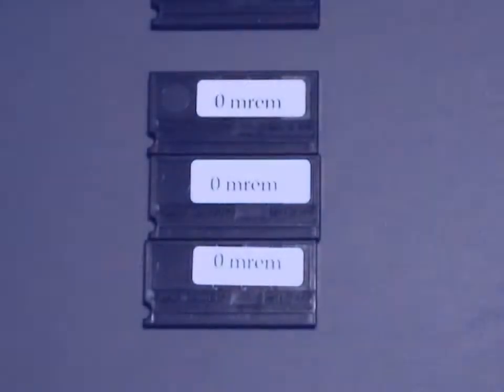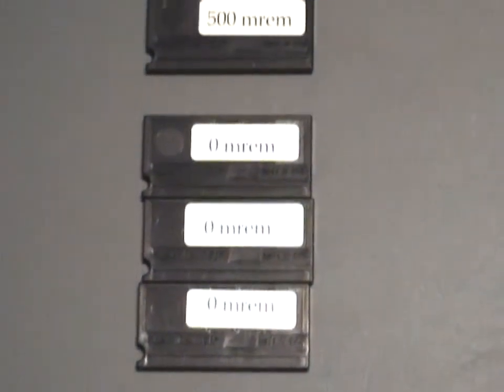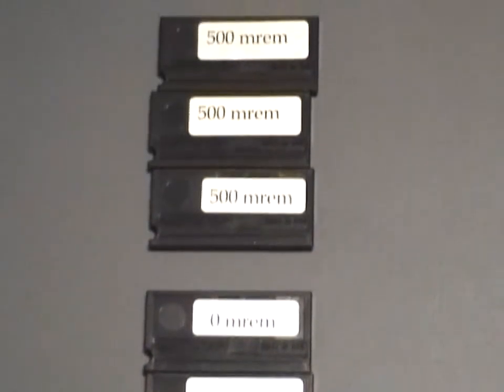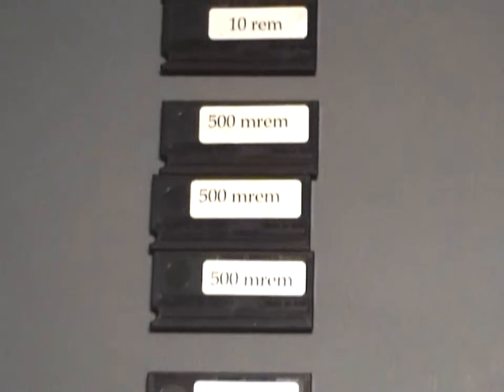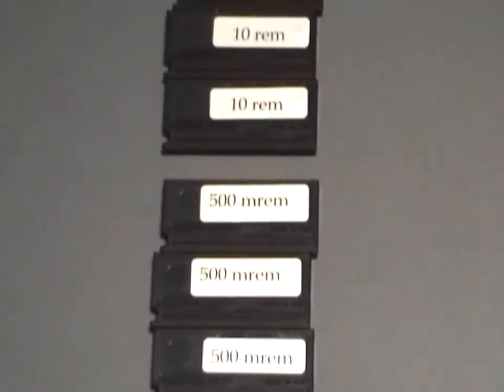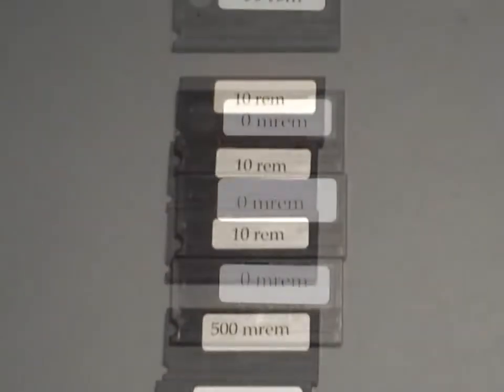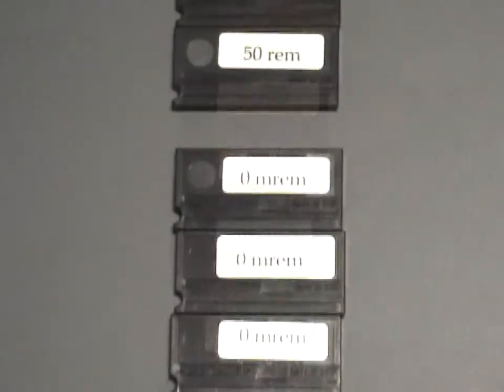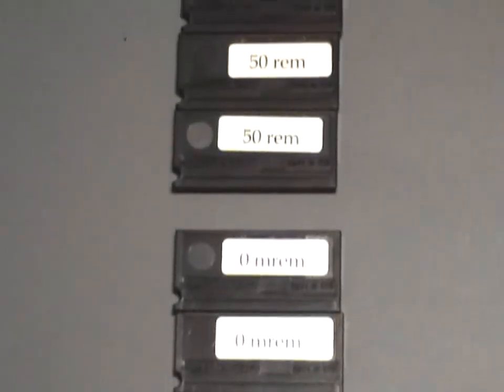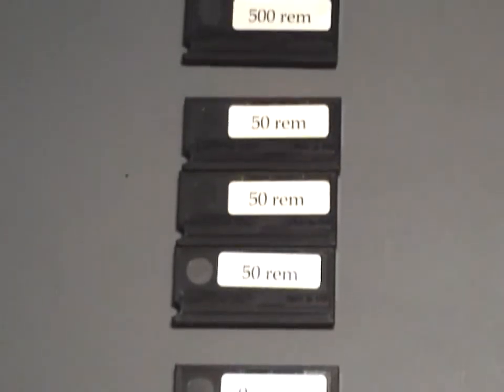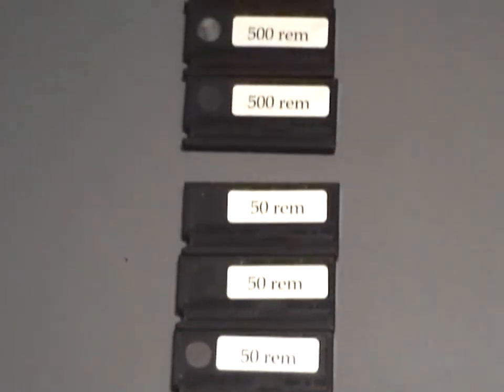The low-dose calibration consists of 0 millirem, 500 millirem, and 10 rem badges. The high-dose calibration consists of 0 millirem, 50 rem, and 500 rem badges.